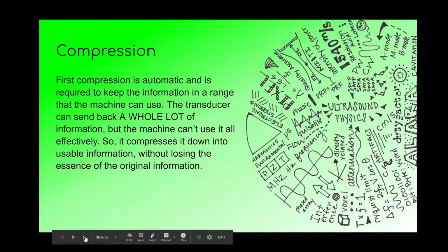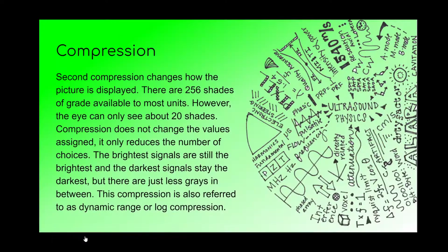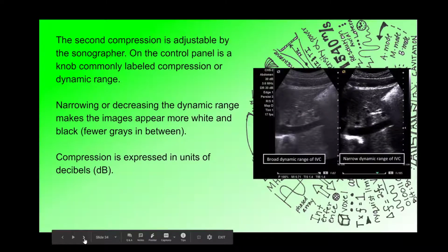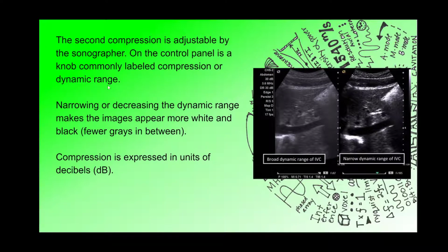So now the machine has what it can handle through the first compression, and that's where second compression comes in. And that is something that you can change as a sonographer. There is typically a knob somewhere on your machine called compression, or I believe there are some other names for it here. Pull that slide up. Compression or dynamic range is usually what it is labeled.